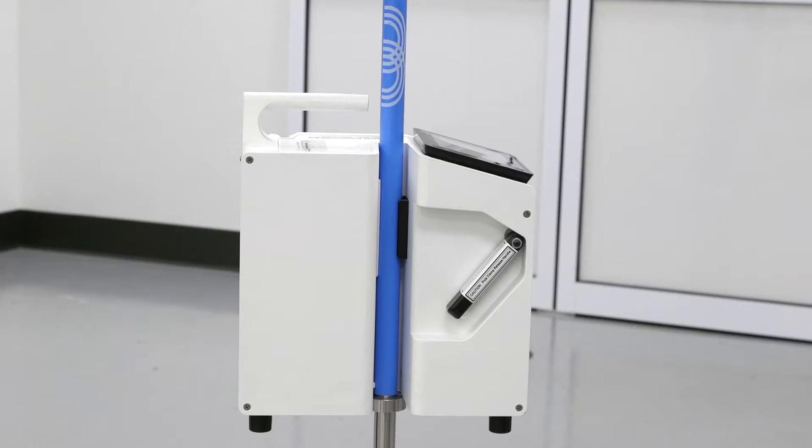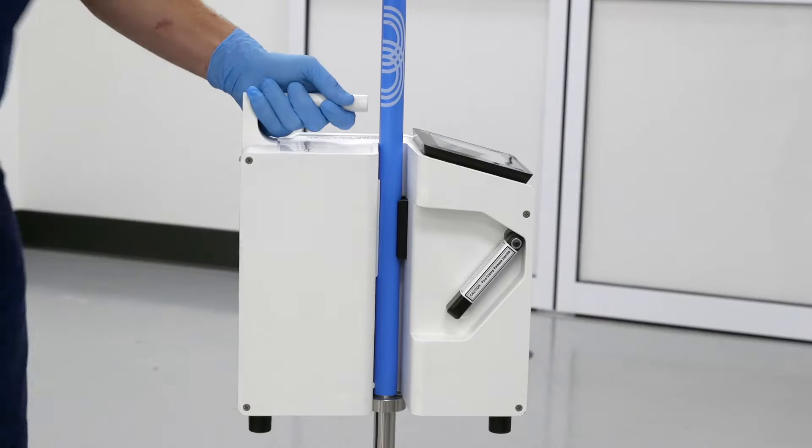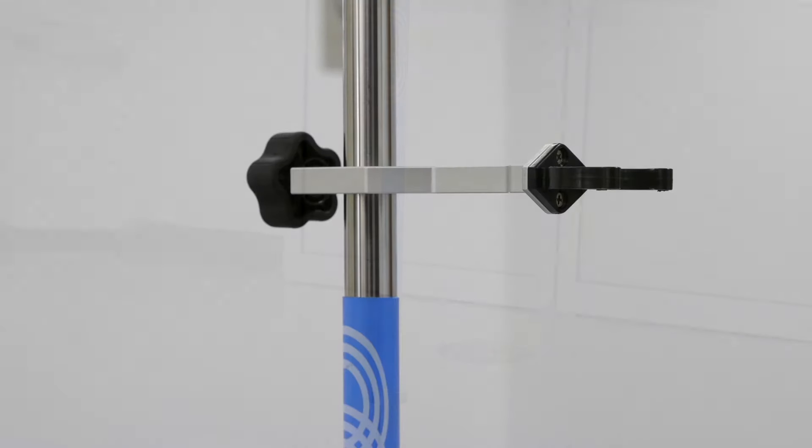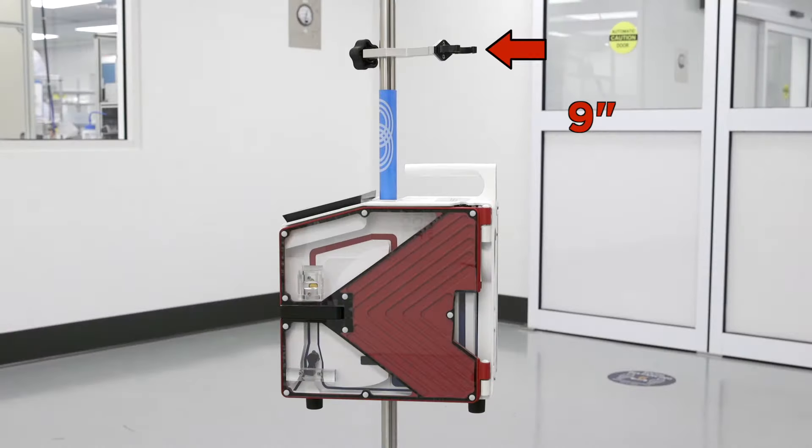To remove the system, lift up on the pole release clamp while holding on to the top handle. This will prevent the system from falling. Install the small reservoir support approximately nine inches above the top of the system.